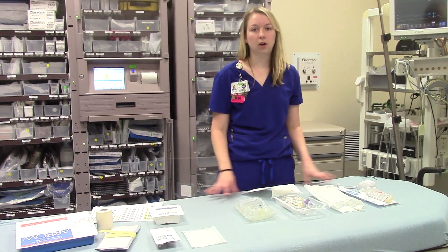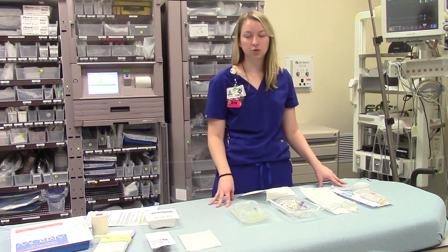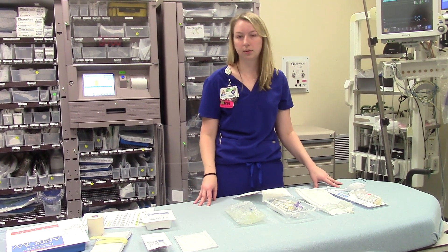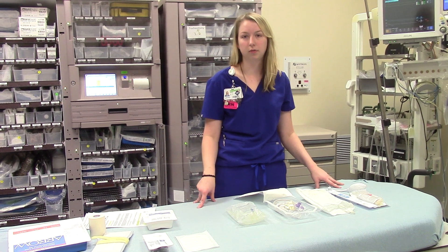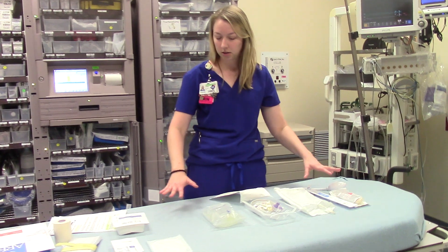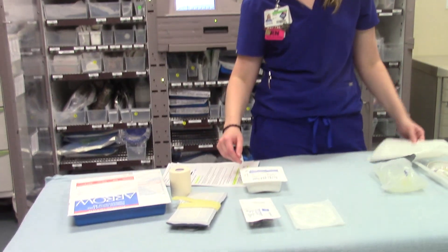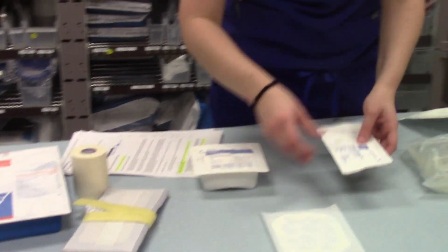Today we're going to go over how we set up an arterial line here in this department. We'll usually use the radial, but we'll touch a little bit on femoral art lines as well, because you'll need to set up a transducer for that. We've got our supplies laid out here, so we're going to go over the radial art line first and what we need for that.